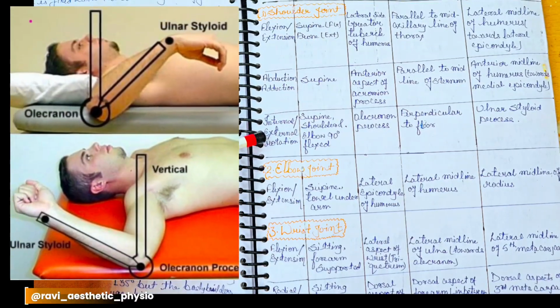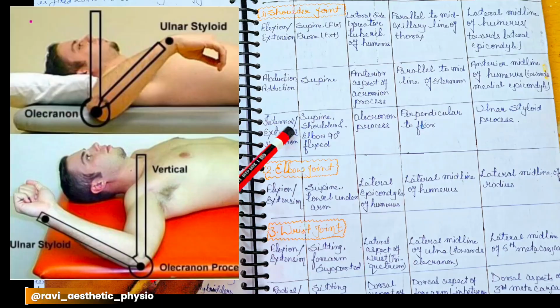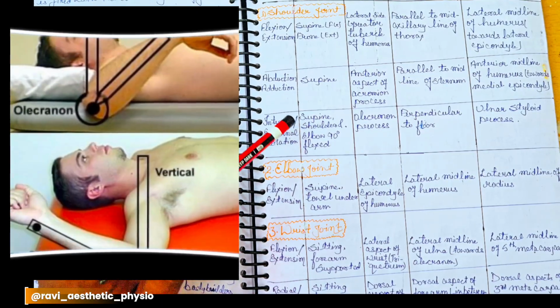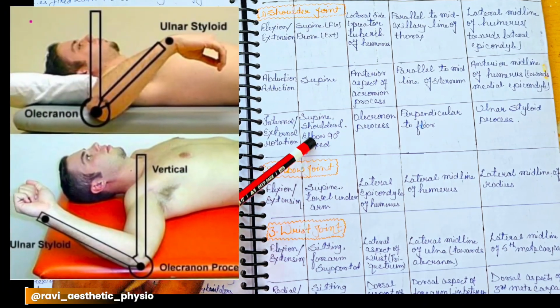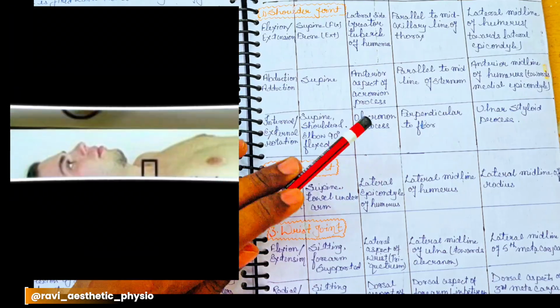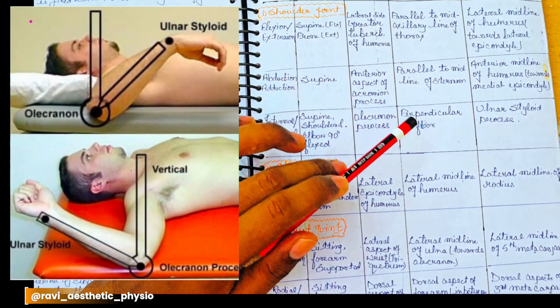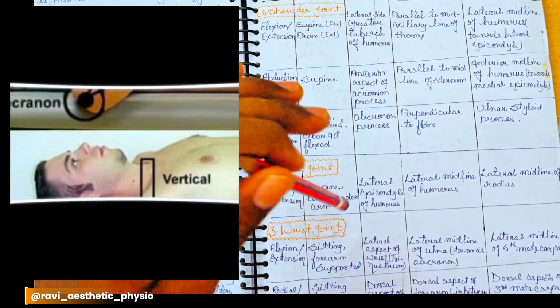Internal rotation and external rotation. Make sure the patient is supine with 90 degrees of shoulder abduction and 90 degrees of elbow flexion. So the patient position is supine, with the shoulder abducted and the elbow flexed to 90 degrees. The fulcrum is placed over the olecranon process and the stationary arm is perpendicular to the floor, because the elbow joint is at the edge of the plinth.